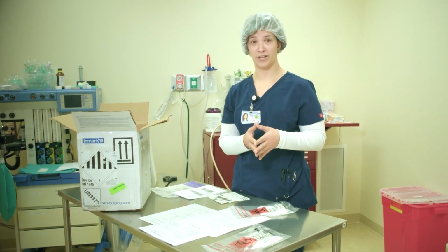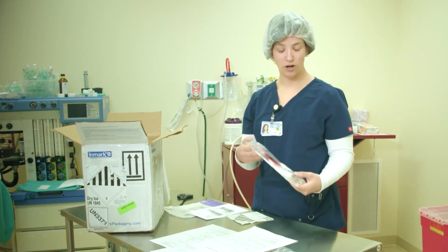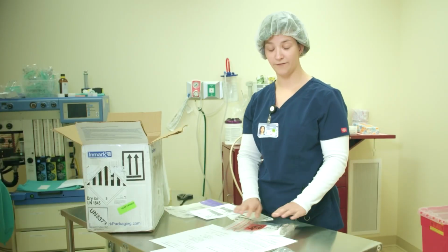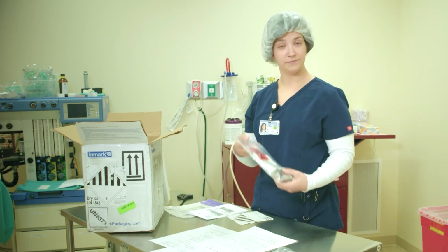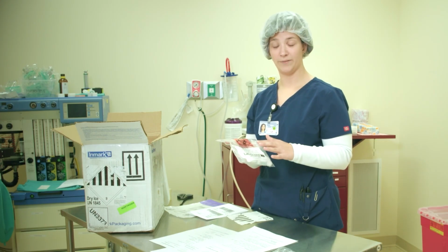Once you gather all your samples, whether it be on dry ice or from a freezer, you can place them all in a single biohazard bag as long as that bag is able to lay flat. You could have 15, 20 samples in one bag as long as it's laying flat.